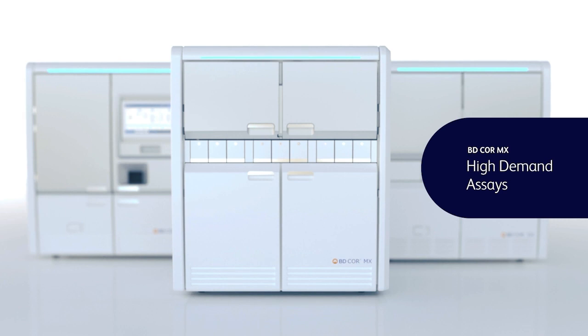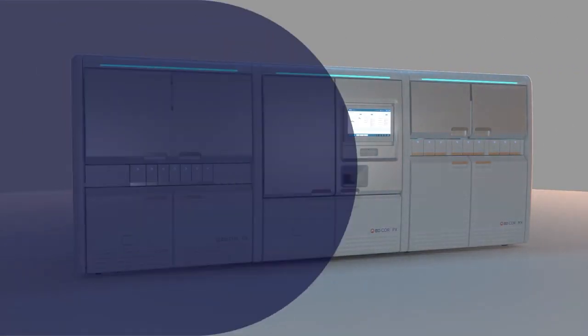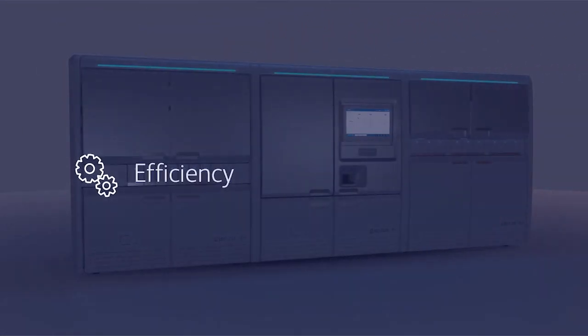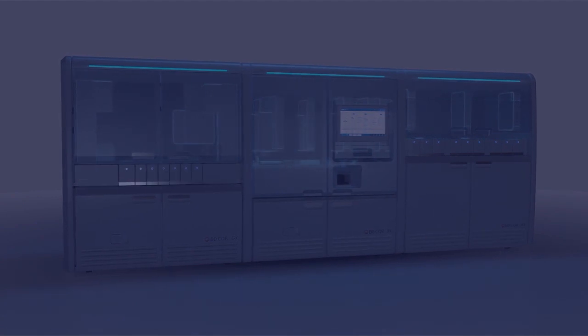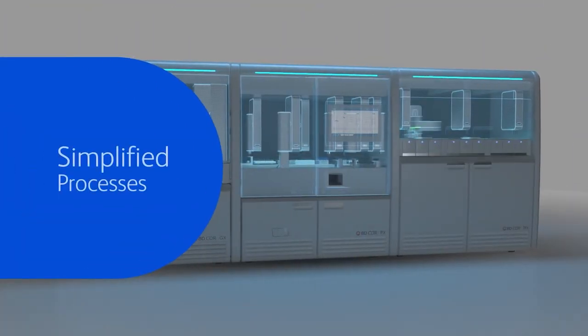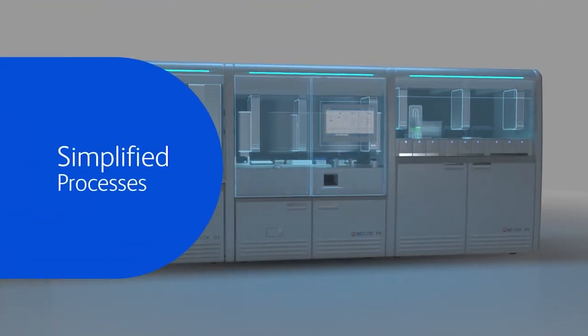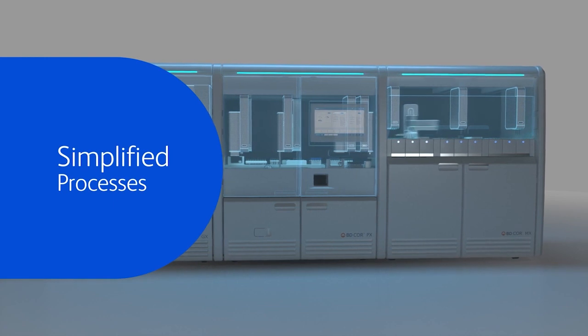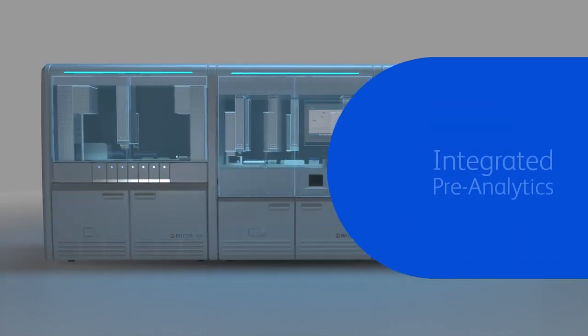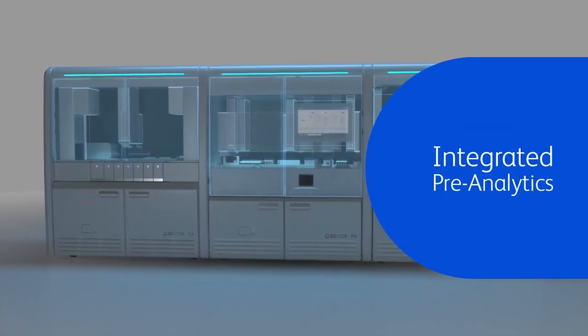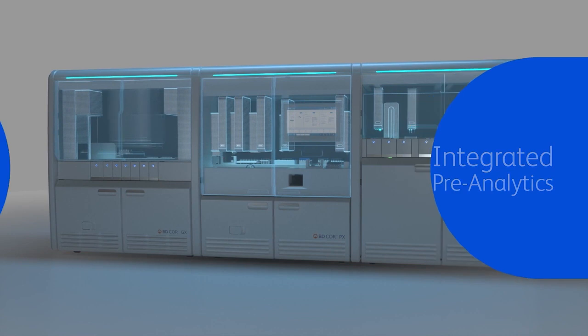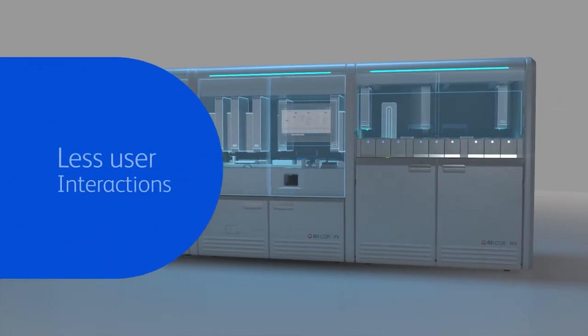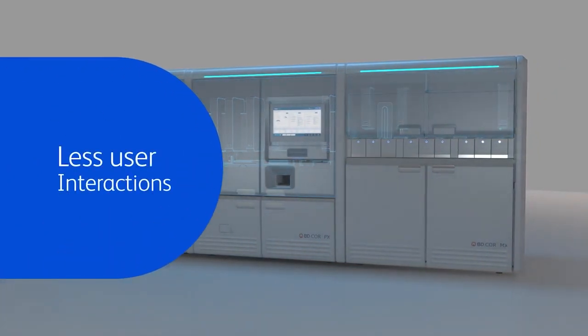The BD Core System delivers efficiency. BD Core System simplifies and standardizes both pre- and post-analytical processes. Automation with integrated pre-analytics reduces the number of touchpoints, making high-volume testing simple, easy, and less prone to error.